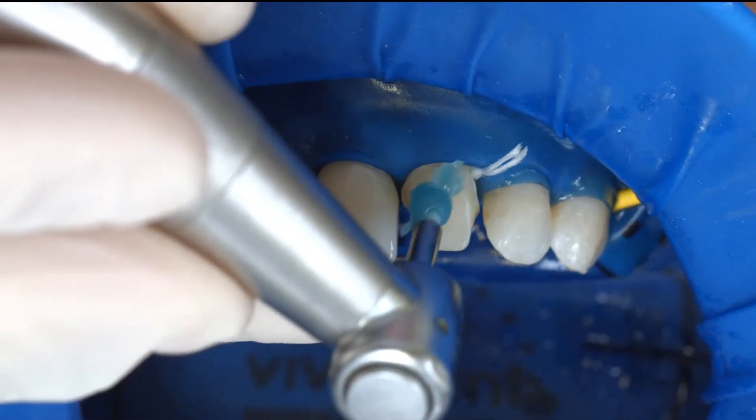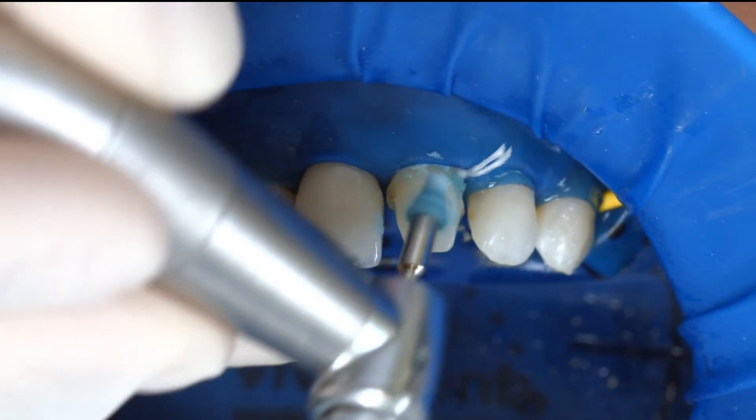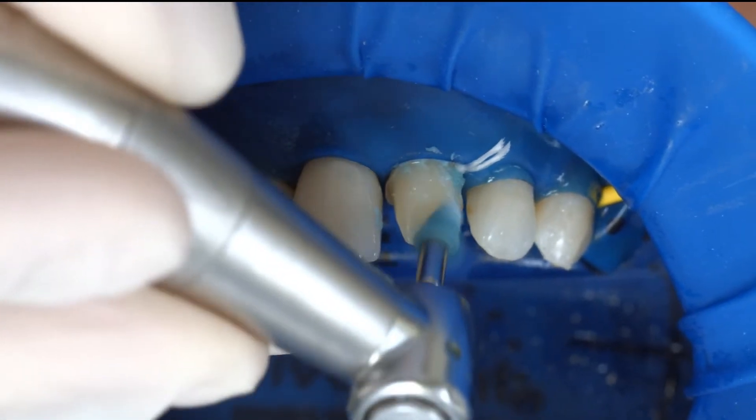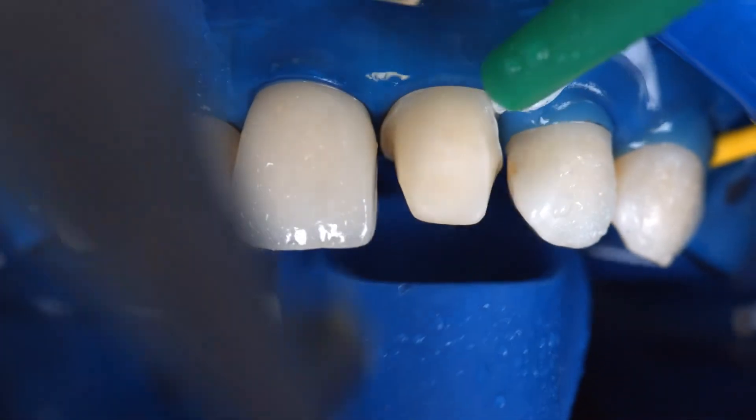Clean the preparation again with a polishing brush and a fluoride-free cleaning paste such as fluoride-free Proxit. Rinse the preparation with water spray and dry it with air. Avoid over-drying.